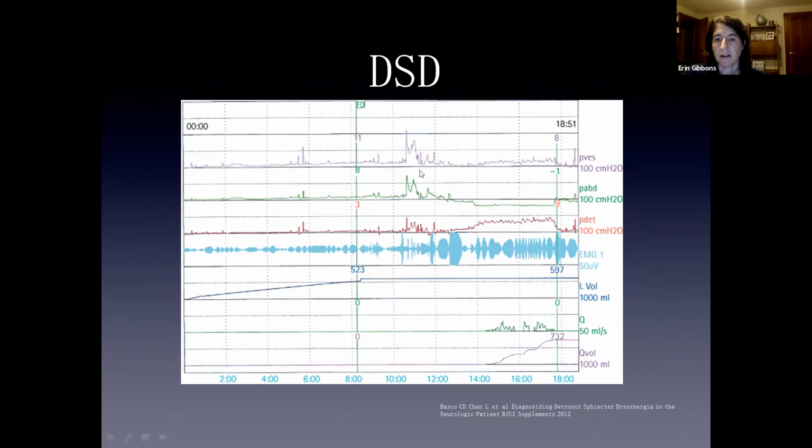Now here, the person is going to try to, so you're getting some spasms within the bladder, and you're going to get some more activity. And then here, the detrusor is contracting. So here's urination. When you see the urine coming out down here, we know that's urination. We see a contraction of the detrusor here. We see pretty low abdominal contraction here.